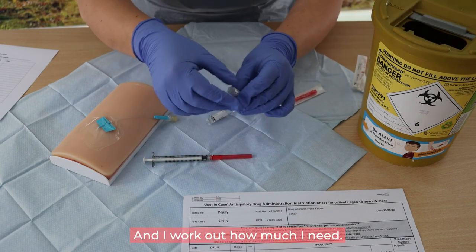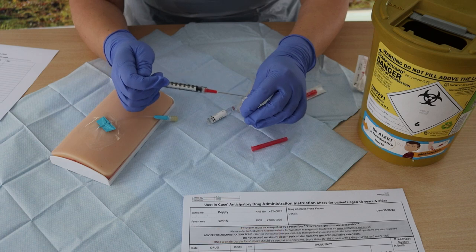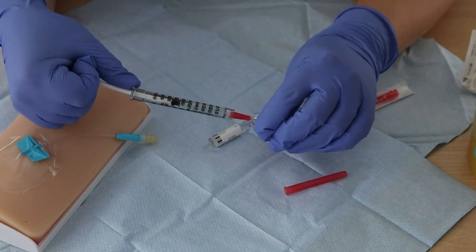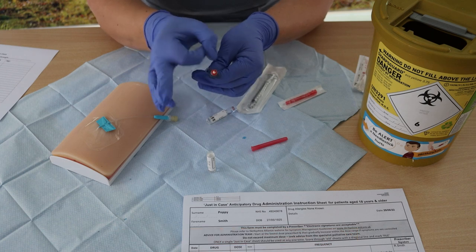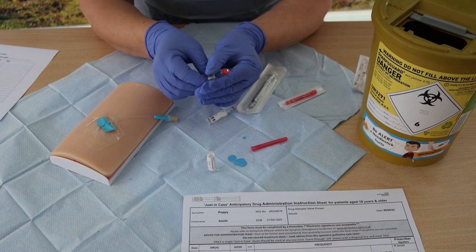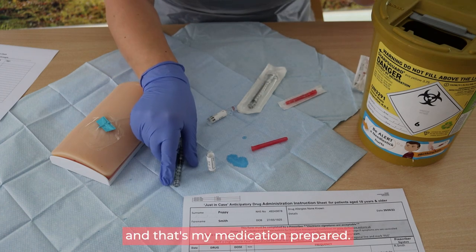I'm going to work out how much I need. I've got 10mg in 2ml, so I want 0.5ml. I'm going to draw that up slowly, just getting rid of any air and making sure I've got the right amount of medication. I'm going to place that down, get rid of my needle — and that's my medication prepared.